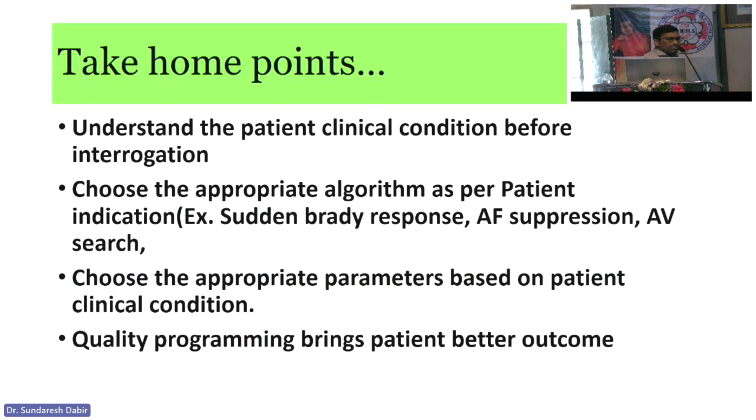Take home points, so we're going to end this. Understand the patient's clinical condition before interrogating. As I initially told, choose the appropriate algorithm as per the patient indication. There are beautiful algorithms like sudden brady response, AF suppression, and AV search. We need to choose the right algorithms for the right patients in pacemakers and program them, and choose the appropriate parameters based on the patient's clinical condition. Parameters are also very important.